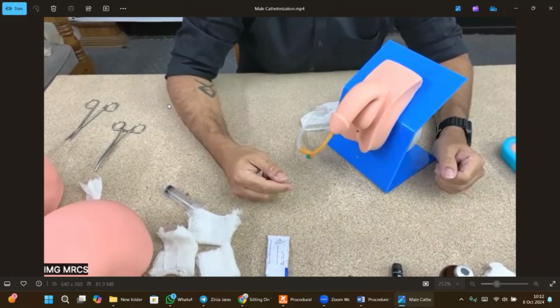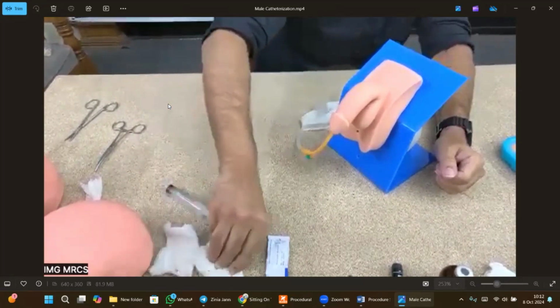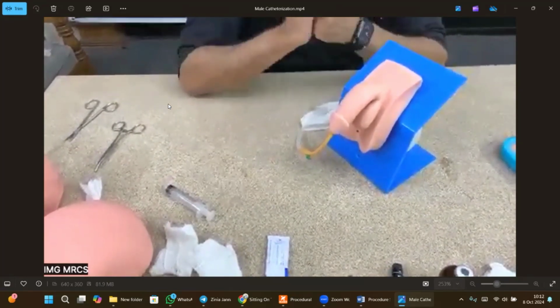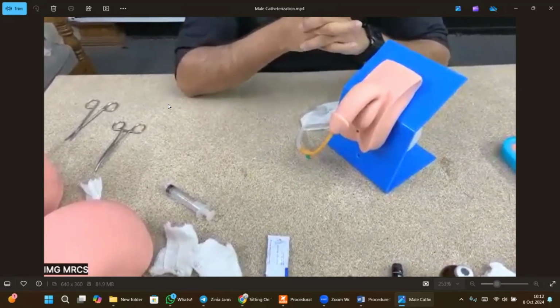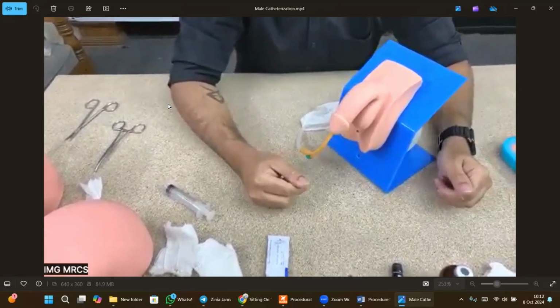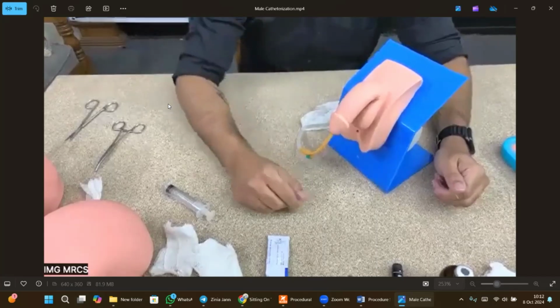Why will the patient be asking for the nurse? Because the patient is already in the hospital, and in most cases the patient is hospitalized, okay? Next, you are going to thank the patient, and then wash your hands, okay? And you are going to mention, now I am going to document my procedure, and also I want to take a sample of the urine after 5 to 10 minutes, and I want to write a request for microscopy, culture and sensitivity. Okay, everyone?